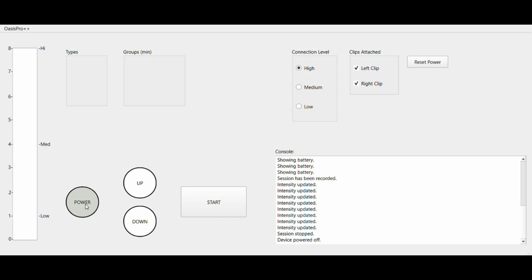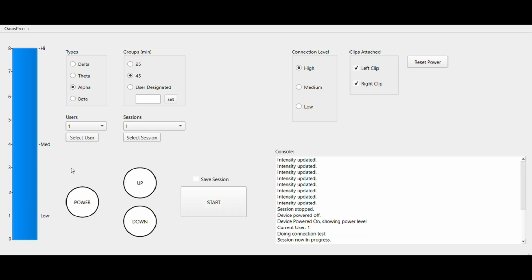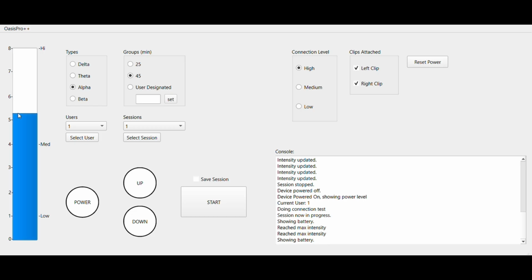So that means if we power on, we can see the battery level. It's drained a little bit since our first test. Now, if we hit select user, you'll see the sessions here, and we can select the session. It'll autofill the parameters here, and then you can just start where you left off. See? And the intensity also stays the same. So our max intensity, we're at 8. And you'll see it'll go through here, and the battery will keep draining. So yeah, that's just the basic use case.